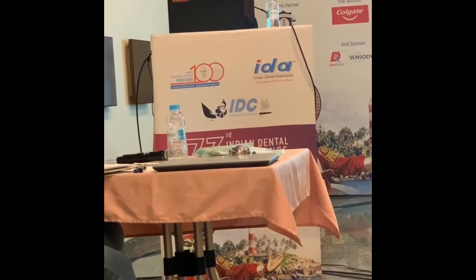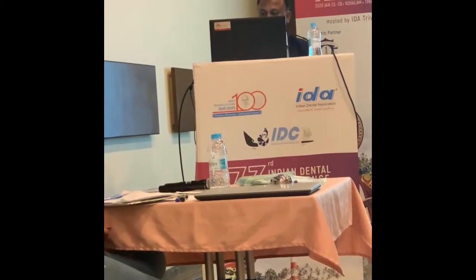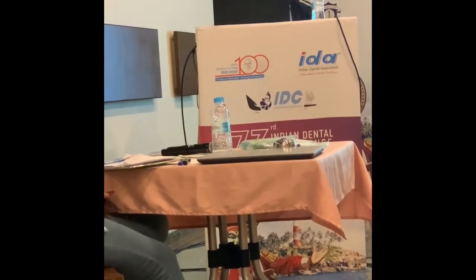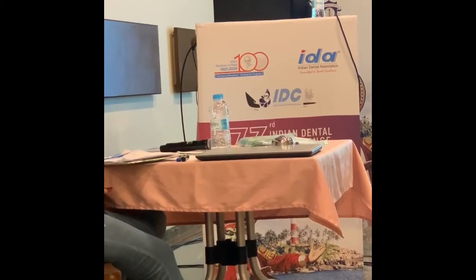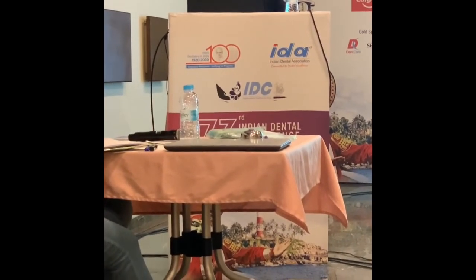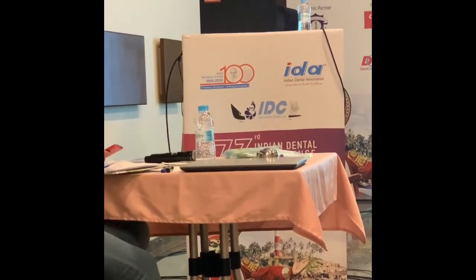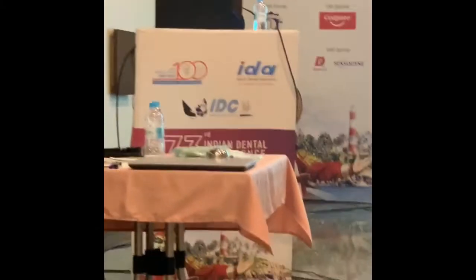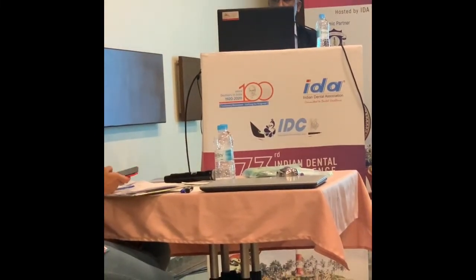And the root position of the adjacent teeth and the periodontium, the anatomy and the position of the implant are very important. So what is the outcome of the posterior implants? You should see the available space, the number of implants and the prosthesis as well. The last picture will show you the screw-retained implants, how they are emerging. But in some scenarios, you won't be able to put the implant in the angulation you want because bone is not available. You have no other option for that. You will have to use the multi-unit abutments and try to bring them into position.